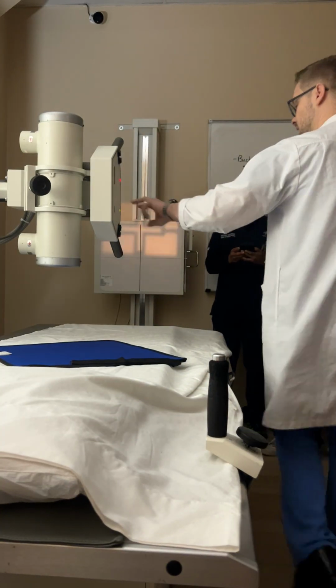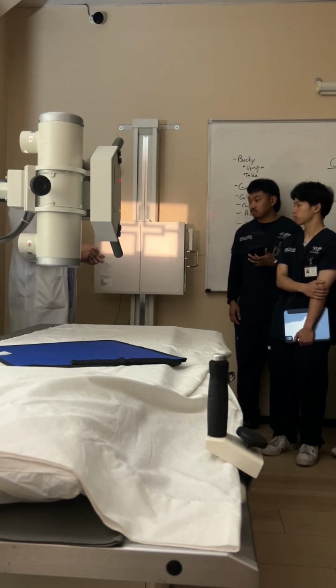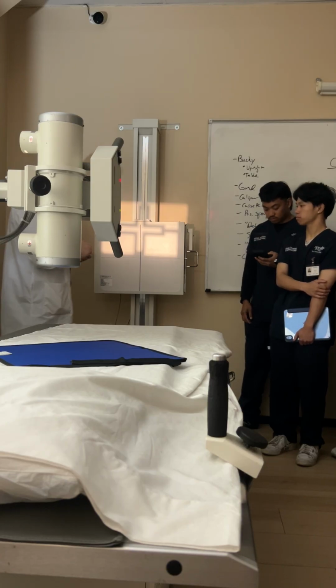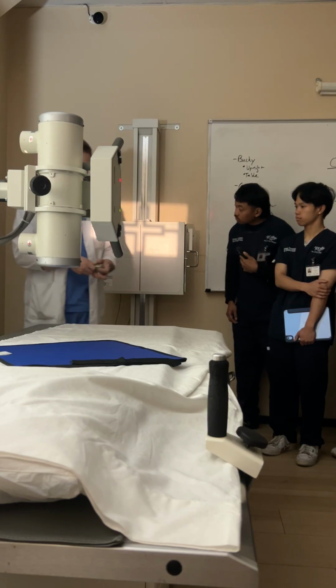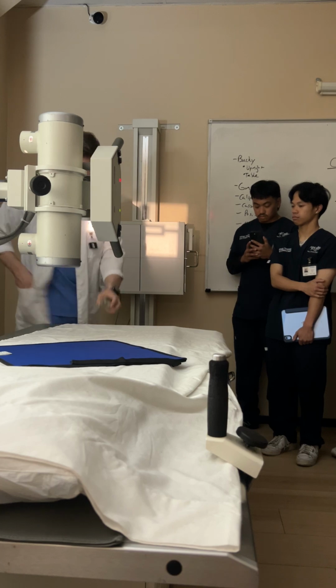So that's one thing. Second thing that I do is I go ahead and pre-mark it, okay? If I have my left marker ready to go, drop it up there, which reminds me I need to get you guys your markers because I don't think we have those in here.